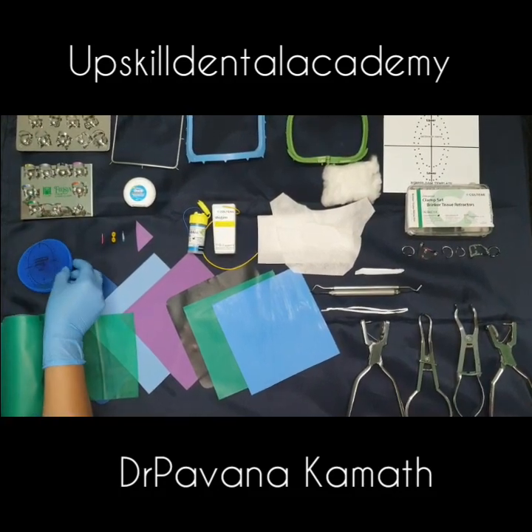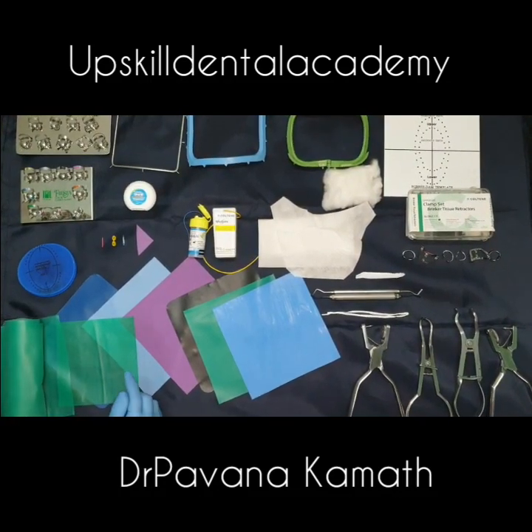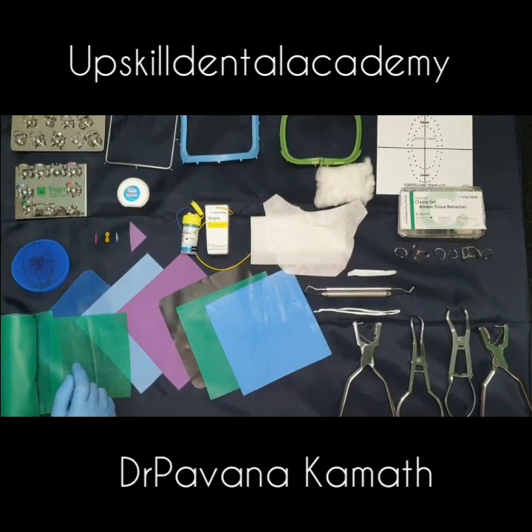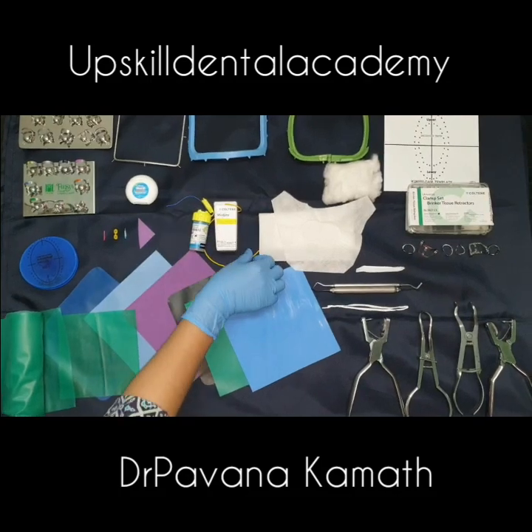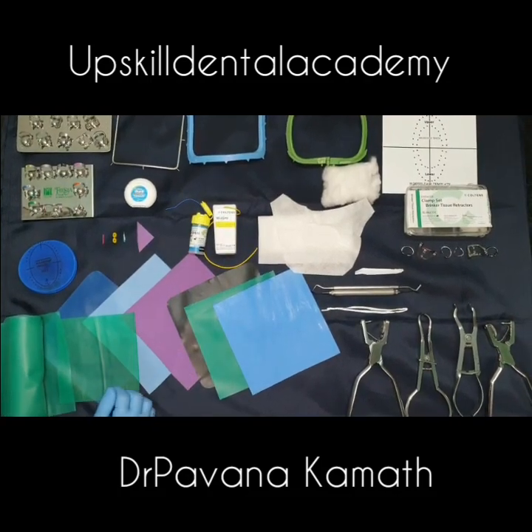This is an insta dam — it helps in quicker placement of the rubber dam sheet and is very useful for aesthetic procedures and bonding. Then we have wedges, which can be of various thicknesses depending on your requirement. It is always better to have different sizes with you.